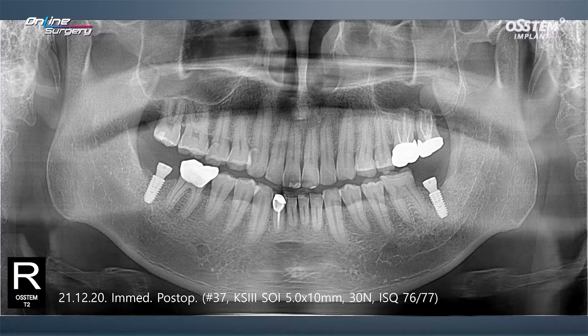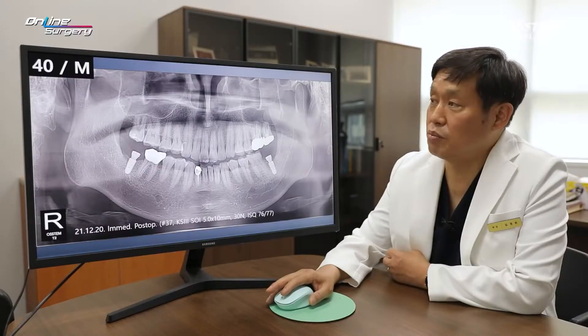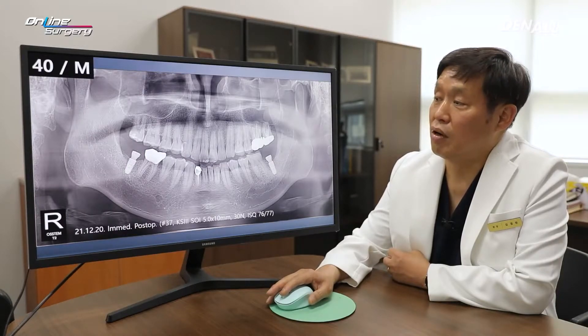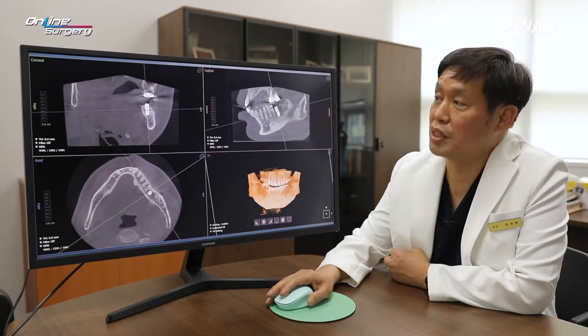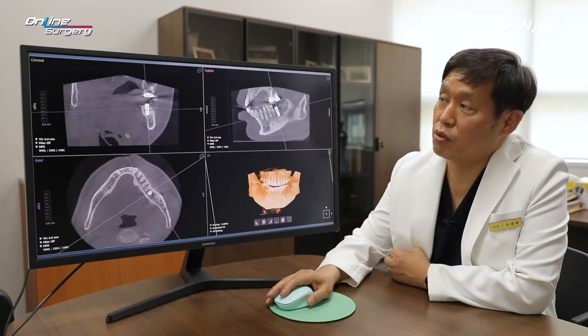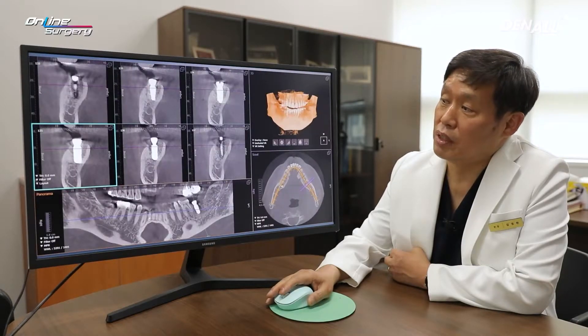Immediate post-op for number 37: a KS3 SOI surface, 5.0 by 10 mm implant was placed. At the time of placement, primary stability was over 30 N·cm and the ISQ value was approximately 76. A healing abutment was connected. On the immediate post-op CT image, there is no major problem and additional bone graft was not done.